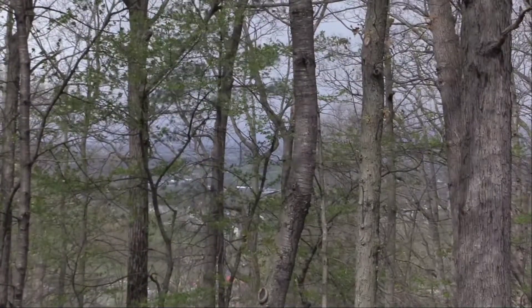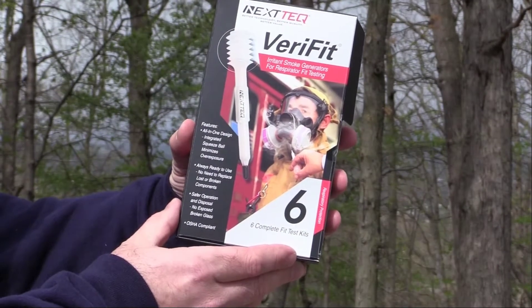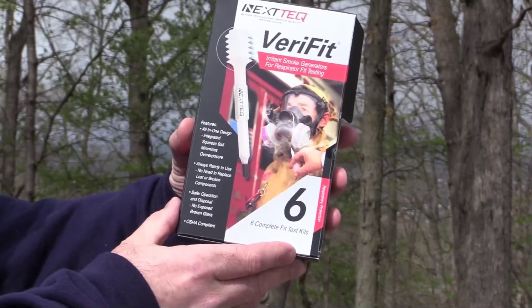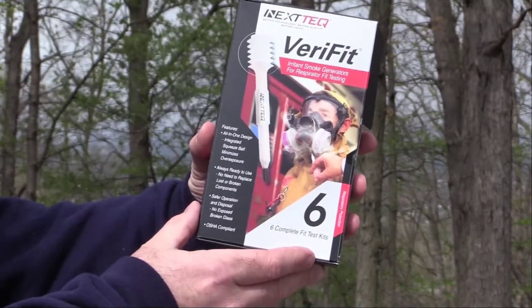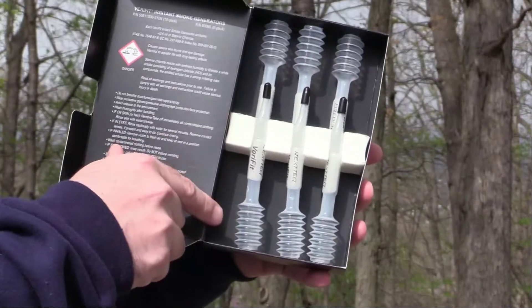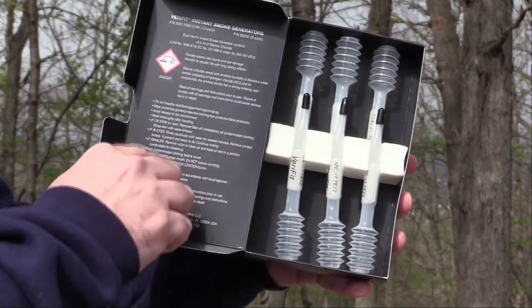Today we'll be using the VeriFit irritant smoke generators for respirator fit testing. They're made by Nextteq, and you can see it's an all-inclusive design, which means we don't have to worry about buying extra components for this to work. When we take a look, you can see the chemicals are in place, there's a bellows, a little cap to keep the chemical contained, and a series of warnings that you really want to pay attention to.